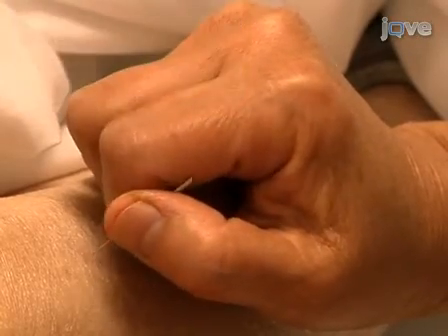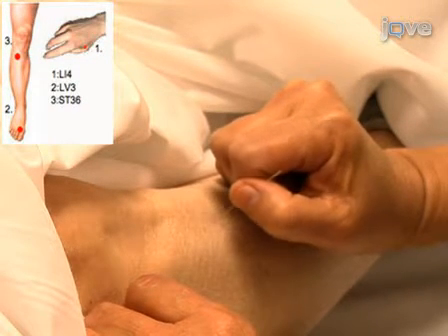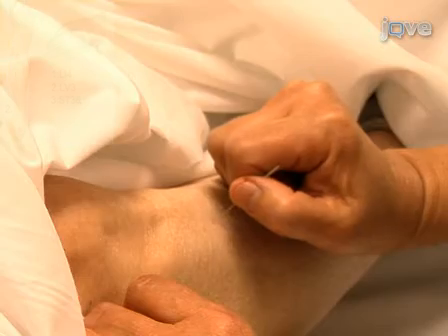Make sure not to approach or leave the subject directly before or after the stimulation period, as that motion could affect the results. Repeat the procedure on the other acupoints.